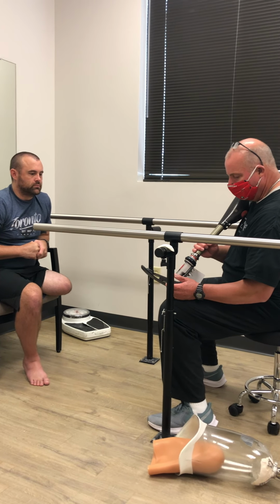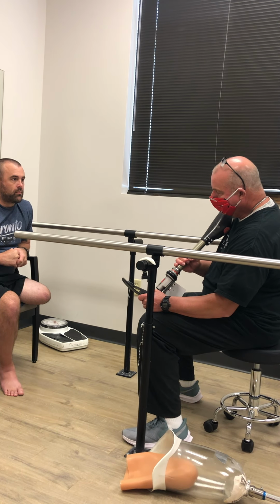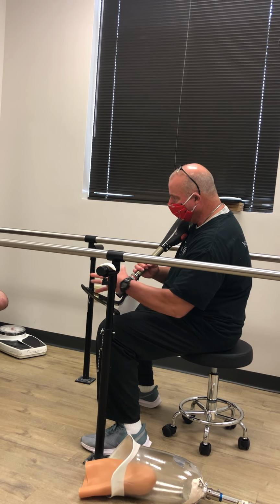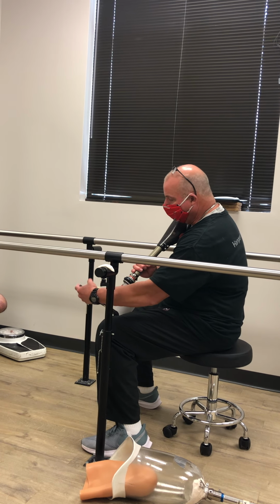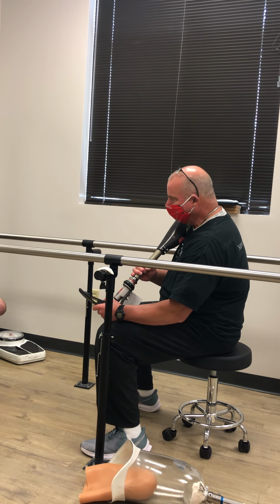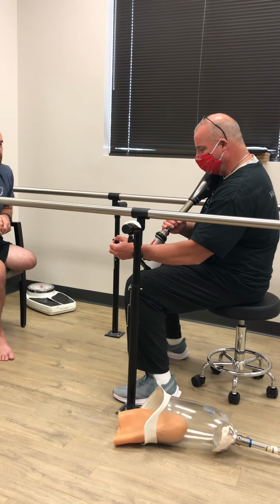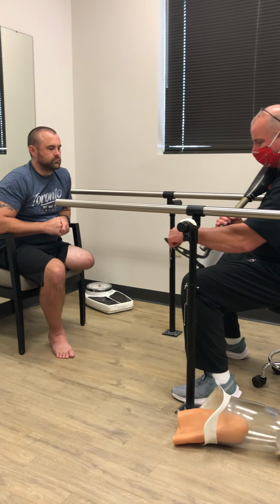Feet usually have a 3-year warranty. And sometimes, honestly, I could still maybe get it under warranty, even with sand, depending on what damage it had. But the cosmetic, the actual foam part, about once a year with somebody who's active, and even if you're wearing them in your shoe, eventually, just from the toes, these Ottobock feet come a little bit farther into the toes. Some of the feet stop where the end of that carbon is.